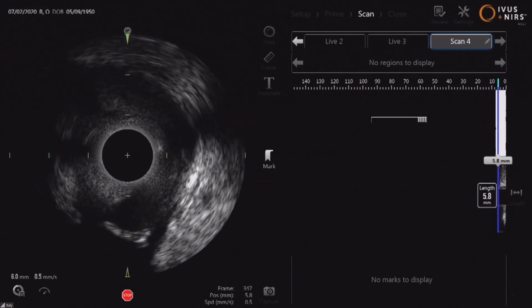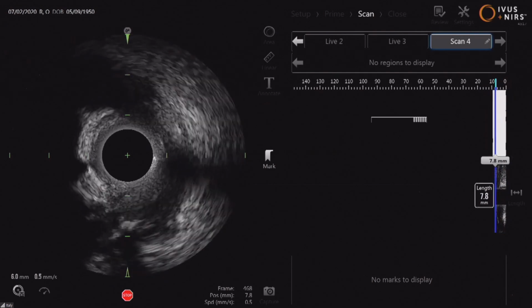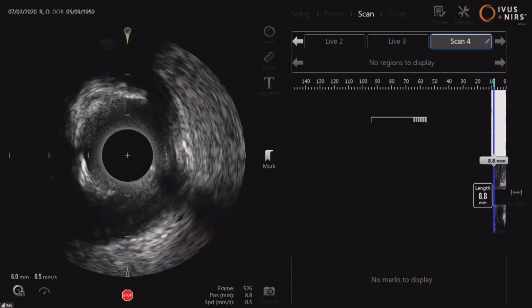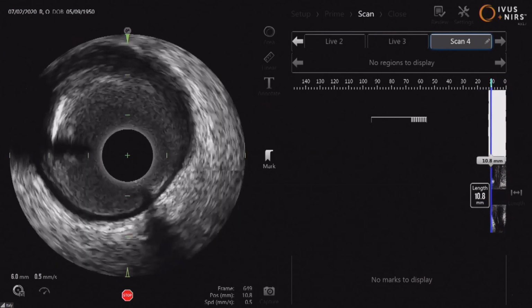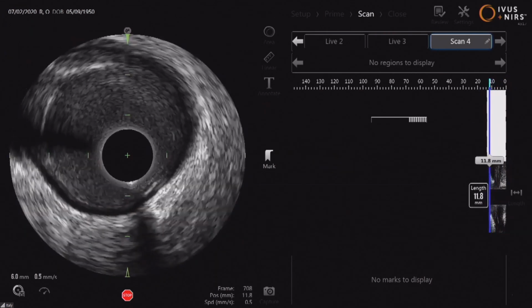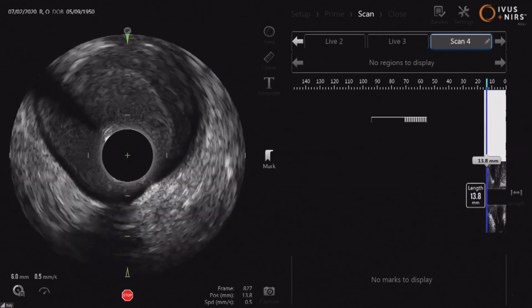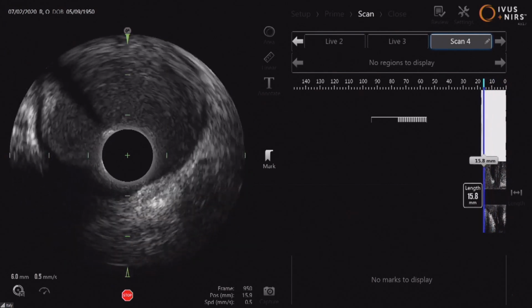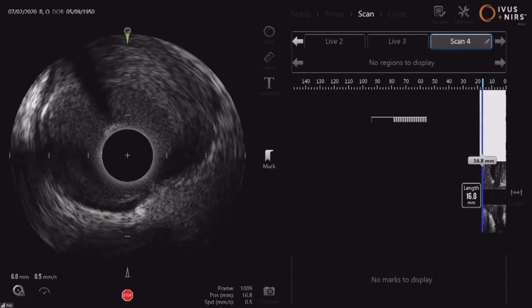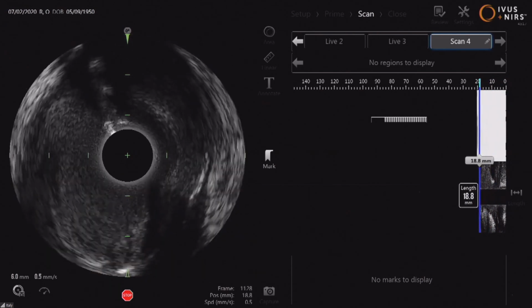But where are we? Okay, that's where there is the aneurysm. I think that there is the aneurysm there. This is a 1, 2, 3 millimeter. You see that we are coming back. So it's definitely a 3 millimeter vessel, and there is almost an aneurysm there. This is the left main.